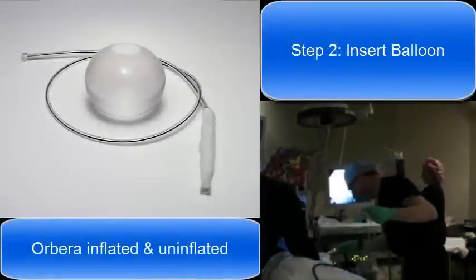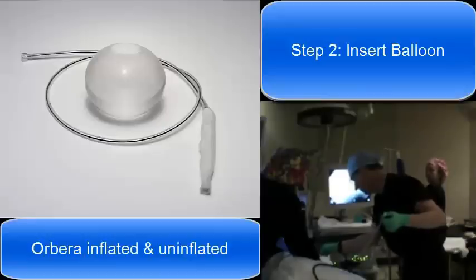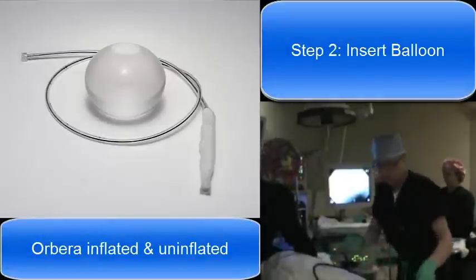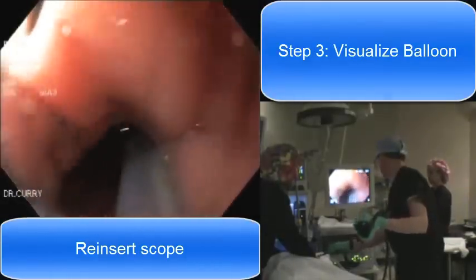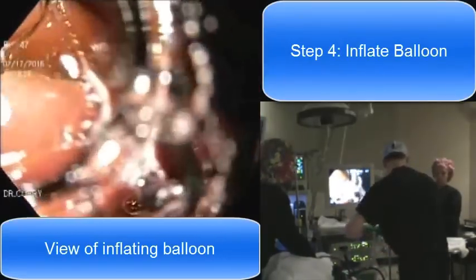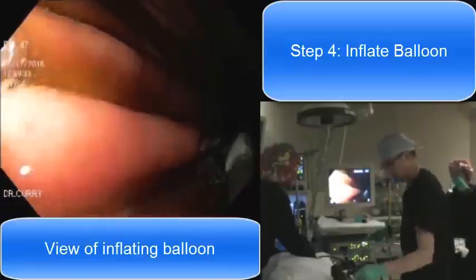Here's a picture of the inflated and deflated balloon. I'm advancing this balloon down into the esophagus now. We don't do this under direct vision — we do it by feel and advance it slowly until we're pretty sure it's in the stomach, and then we'll double check that with the scope. Now reinserting the scope, you can see the catheter for the balloon is there. I'm advancing it down through the esophagus and into the stomach, and there you can see the balloon itself. We want to make sure it's in the middle of the stomach so that we can inflate it and it has plenty of room.